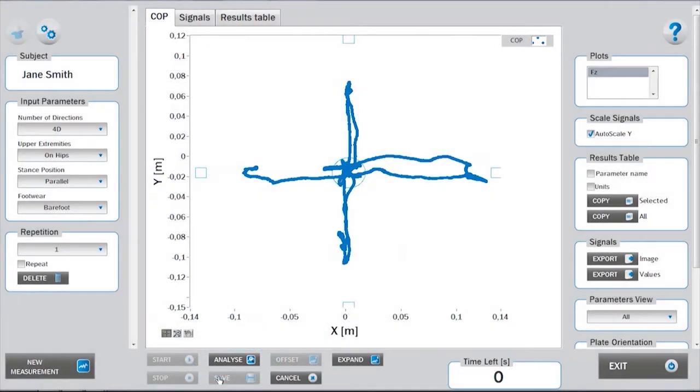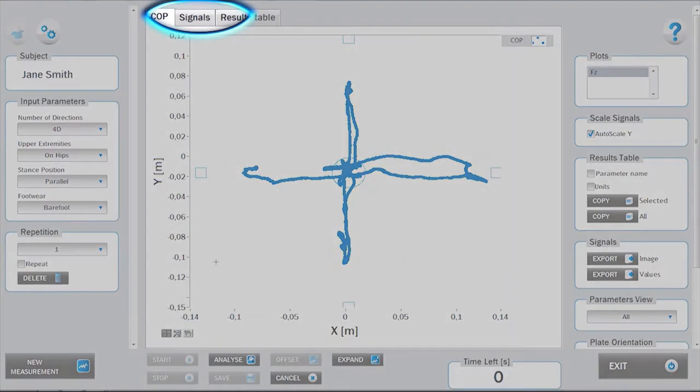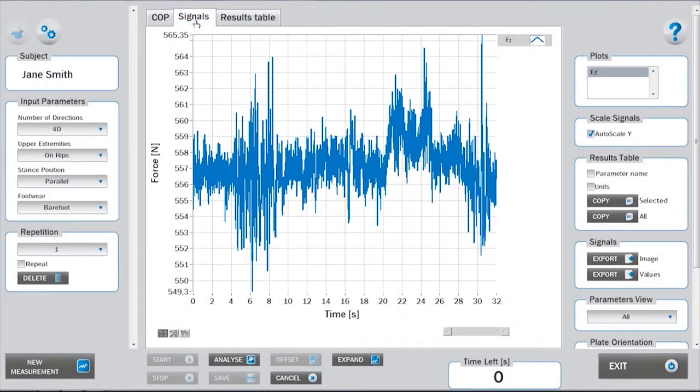The vertical ground reaction force signal can be viewed under the Signals tab. In the settings section, direction-specific ground reaction forces can be added and viewed later.